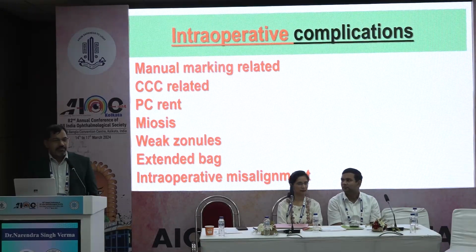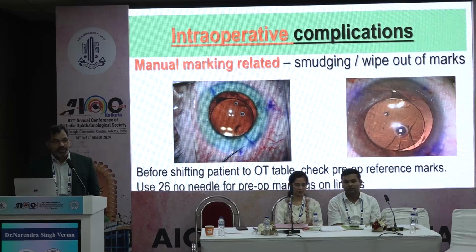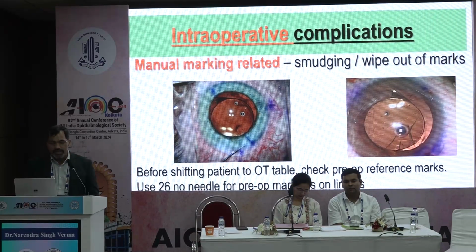Though every time we will not get an uneventful surgery, sometimes there are complications. These are some of the complications. We will see how we will manage these complications. So when we are doing manual marking, there may be a smudging or wipe out of the marks.